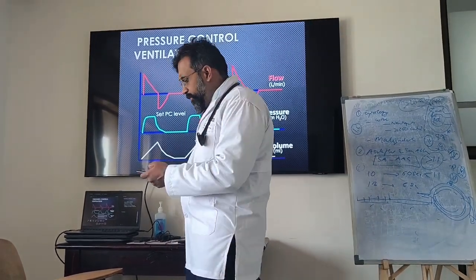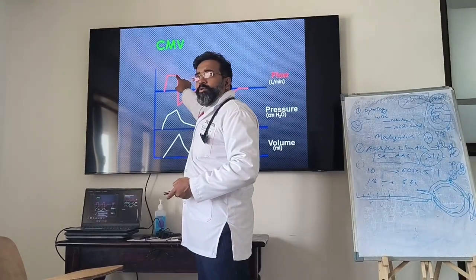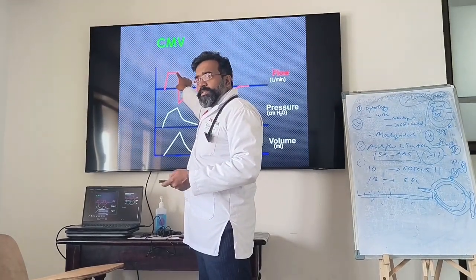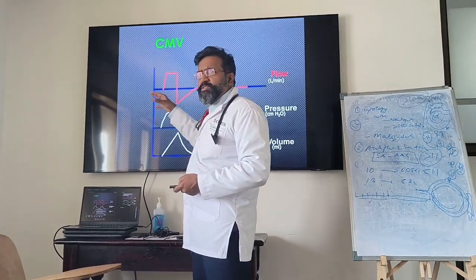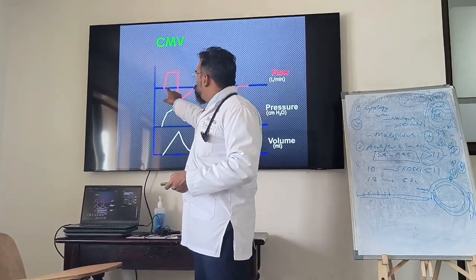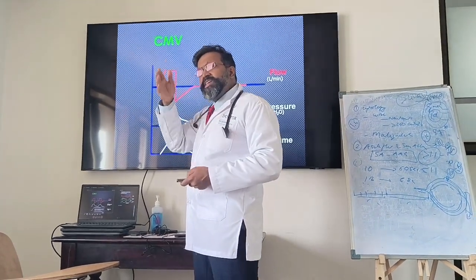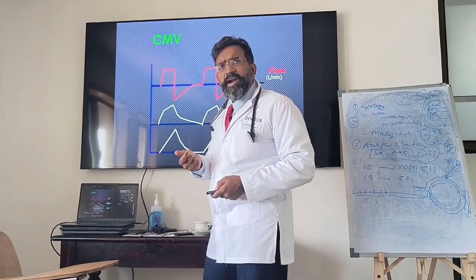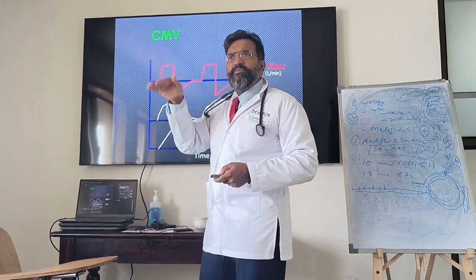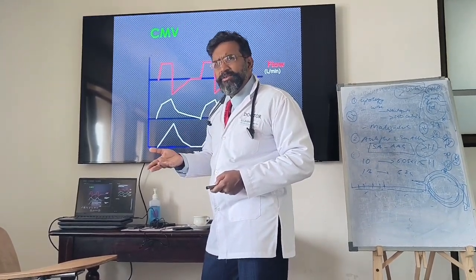हाँ, so you will tell me अरे ये भी तो वैसे ही तो था. इसमें हमने इसको pressure limit कर दिया, इसको तो flow limit कर दिया हम लोग ने. ऐसा बोलोगे ना? But no, these are waveforms. These are flow waveforms. This I can set. Tomorrow this is called a square waveform. I can make it decelerating waveform. From the ventilator I can change that. You're understanding? I can change the flow from being square flow to decelerating flow pattern. I can do that. You're understanding?